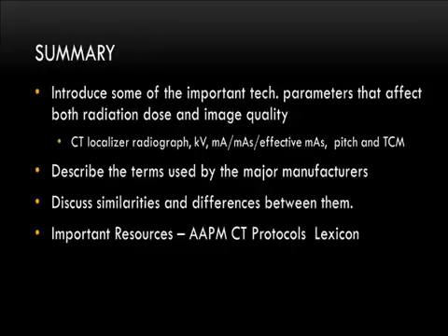Did you all hear that in the back? No. Okay, so let me see if I can paraphrase, and if I get it wrong, then I'll be corrected by Siemens. The quality reference mAs does not need to be adjusted by patient, but it should be adjusted by clinical indication or the purpose of the exam.